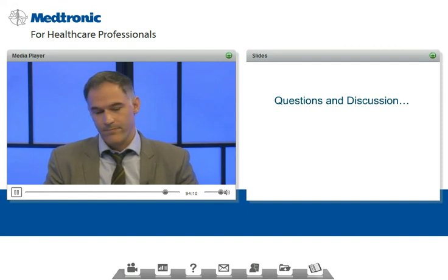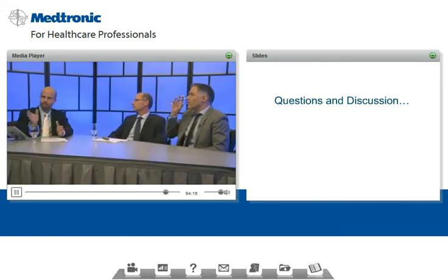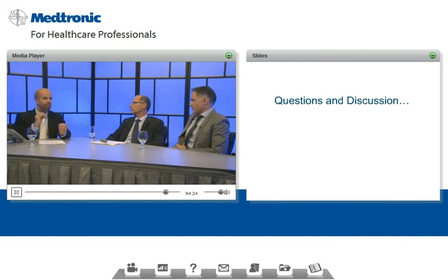Very good. So, I mean, it certainly sounds like it's integral in both of your practices. A couple of other questions that might be a little more particular to the case study. Dr. Cohen, for the pregnancy study, certainly as diabetes educators in Canada, and I'm sure beyond, we are really trained to hone directly in on hypoglycemia.